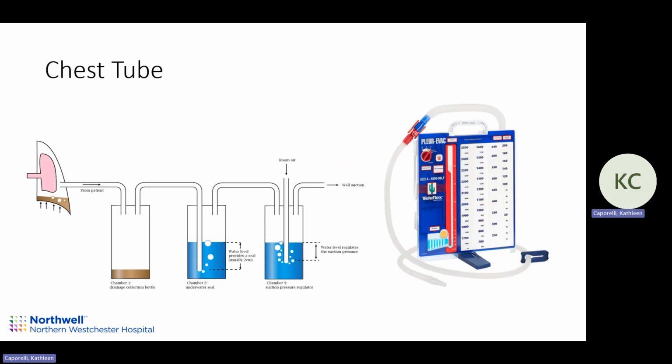All right, chest tube. I think this is really, really important. Basically, any patient where I go into the pleural space, I'm going to put a tube in. Have you guys seen this picture, this concept of the 3-chamber system? This is the old way they managed entering the chest, because for a very long time, people didn't really know how to operate in the chest because patients would die anytime they went into the chest.